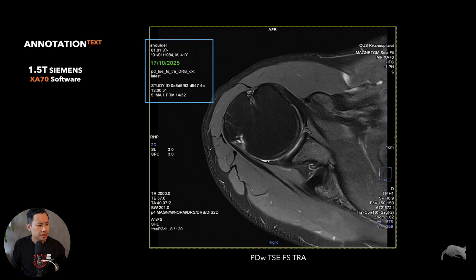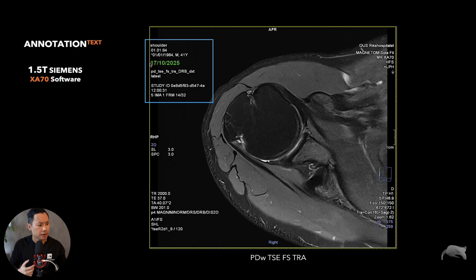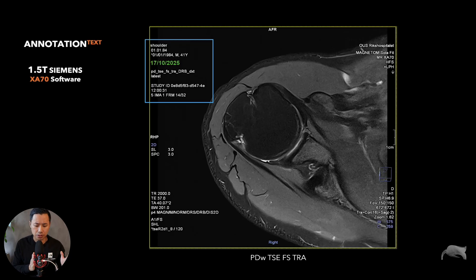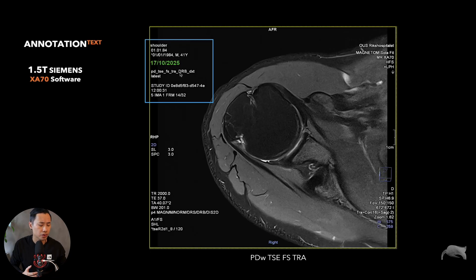In the upper corner here, this is the name - I just called it 'shoulders'. If you have a patient, you have the patient name and the birth information. This is the date which was scanned and this is the name of the sequence. I really recommend you name your sequences easily and correctly each time. Usually I put the weighting first, then what kind of sequence, if it's fat sat, and what kind of plane.